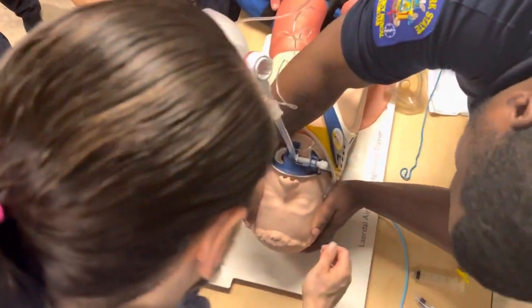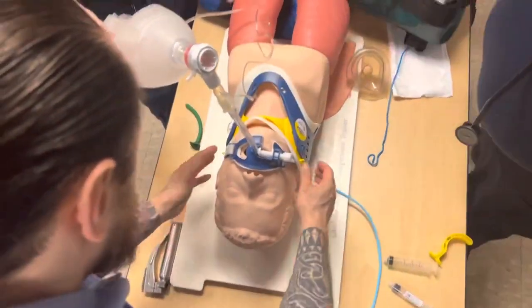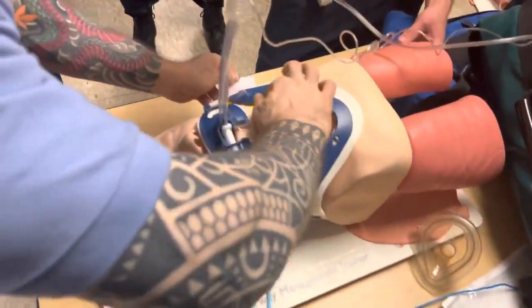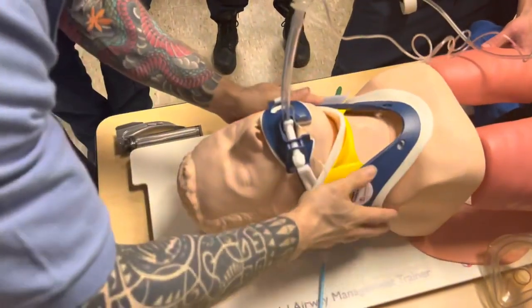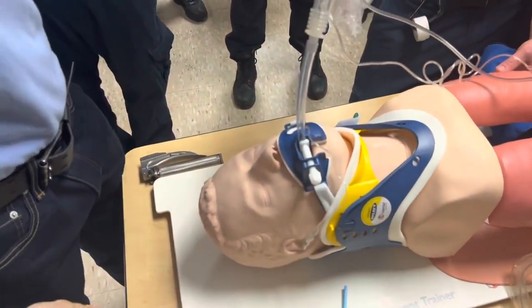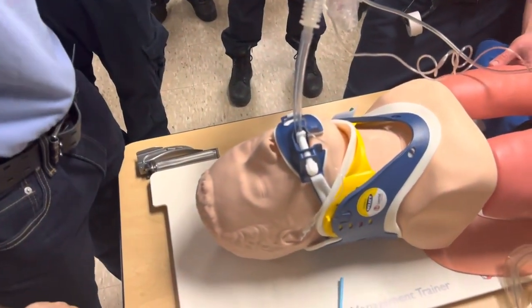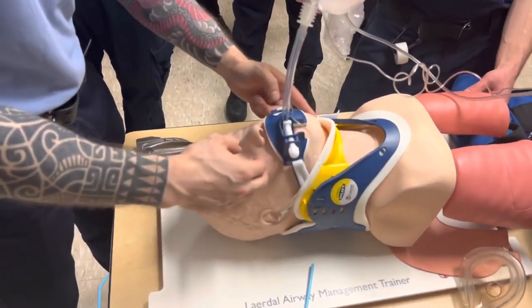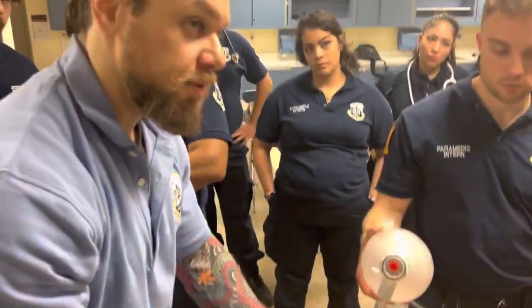All right, so now once the collar is secured, James, you can let go, right? So just slightly, let me put it a little. So once the collar is on, then you could let go. To be honest with you, when we do cardiac arrest management in the field, even if they don't have a cervical spine injury, once I intubate, I put a collar on them. Do you know why? Because you don't want the neck to move and the tube to be displaced.